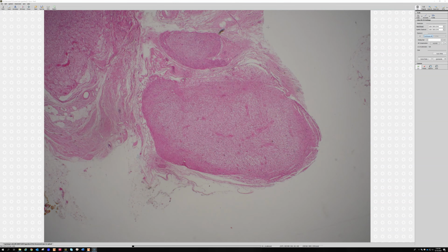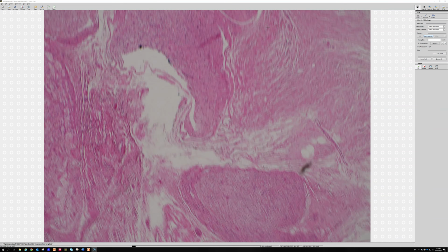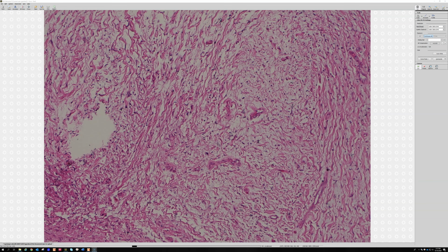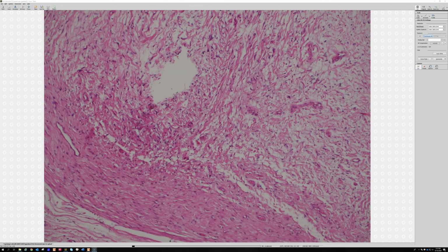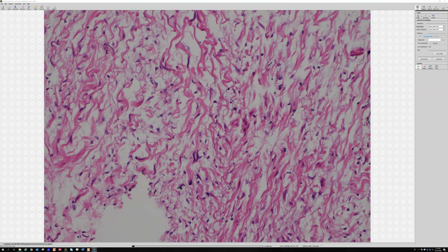So what does this patient have? What disease? Probably neurofibromatosis. Yeah, basically, when you tell someone that they've got a plexiform neurofibroma, you are giving the person neurofibromatosis. So that is why we have to be very, very careful to be totally sure before we ever make that diagnosis. Even though, and here's the S-shaped, those are Schwann cells.